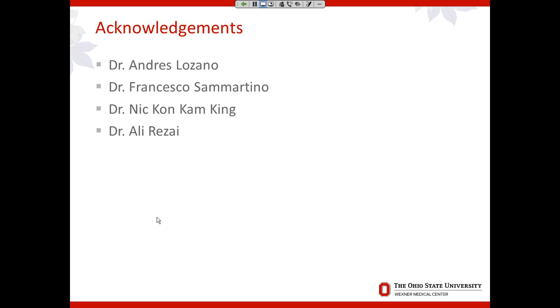For the DBS part, it's easy to use these tracks live for surgery because it's a Medtronic-based targeting system, and you can seamlessly export these tracks into the targeting software. We have tried to do that for our focused ultrasound procedures as well, and we have been successfully able to incorporate them, but there are limitations on how many sequences you can import. So we are able to import the final target that we identify into the system, and we can use that. Then, for sure, when I do the calculations after aligning an ACPC plane, if we are not able to incorporate the images, we can at least know the exact measurements.